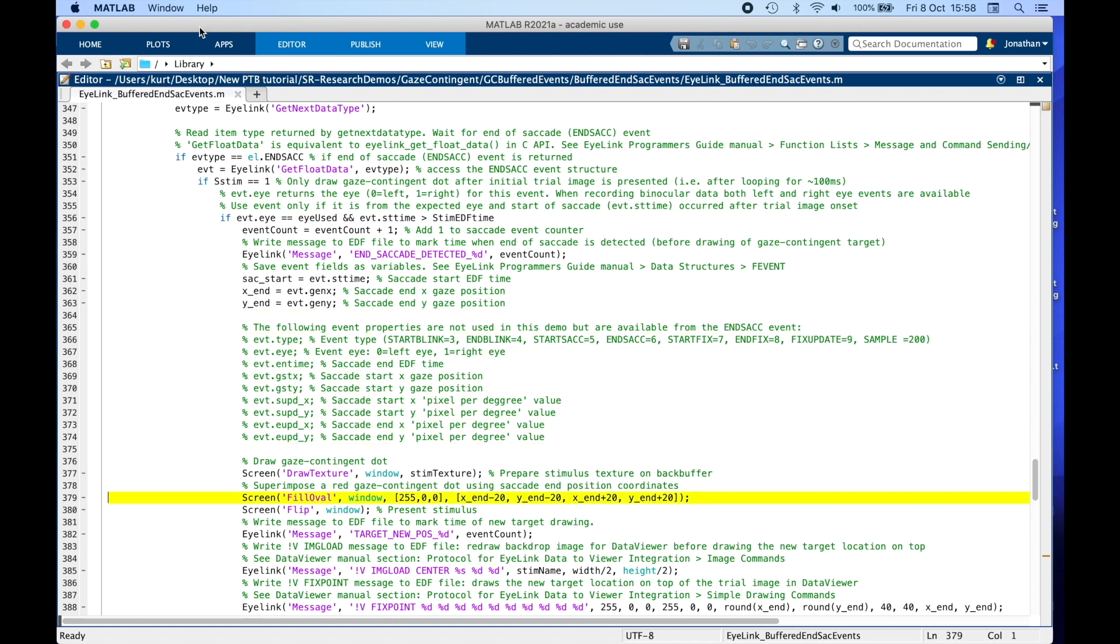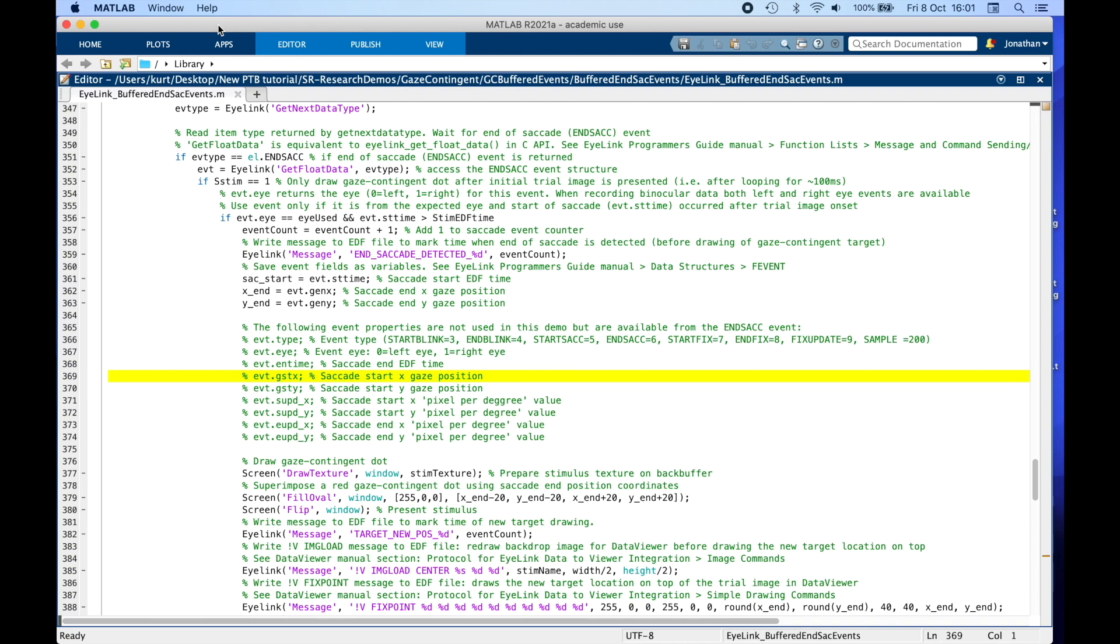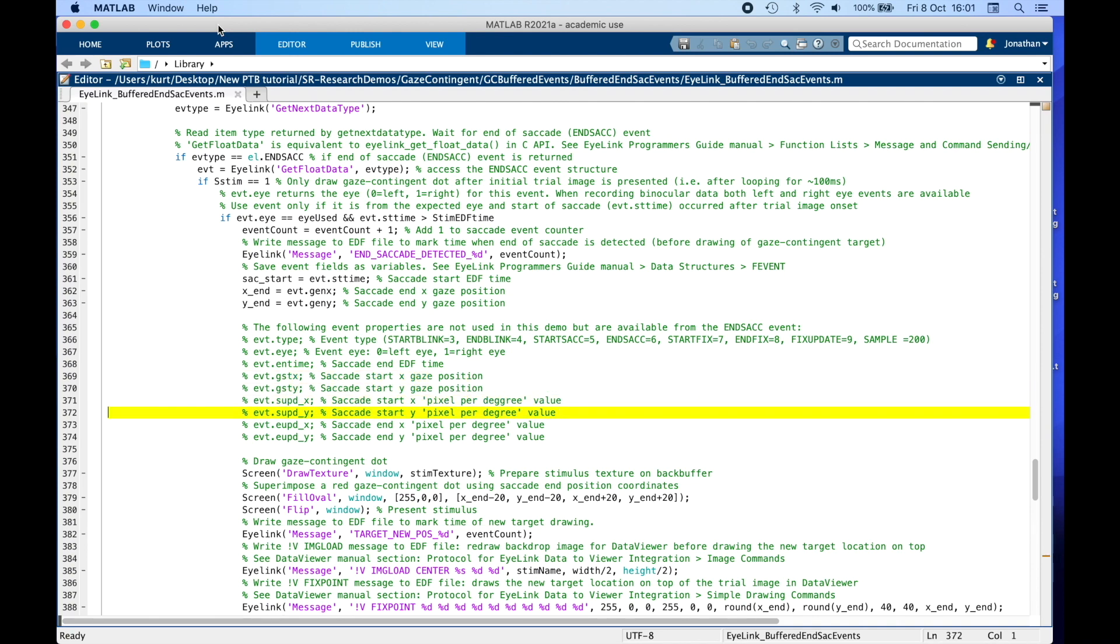We use these end x y positions to update the location of the target, so we draw an ellipse with a 20 pixel radius around the end of saccade location. This is a list of other saccade event properties that you can get online via PsycToolbox.